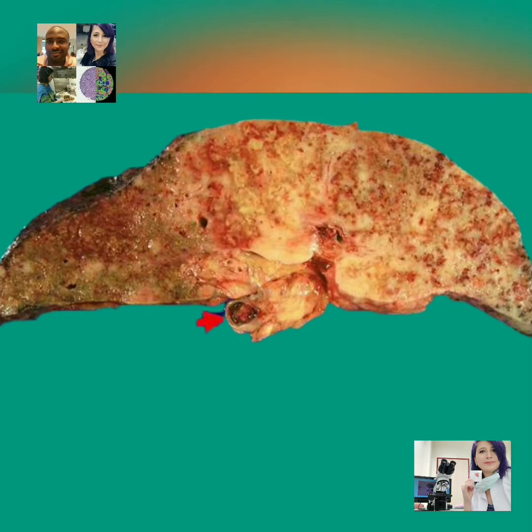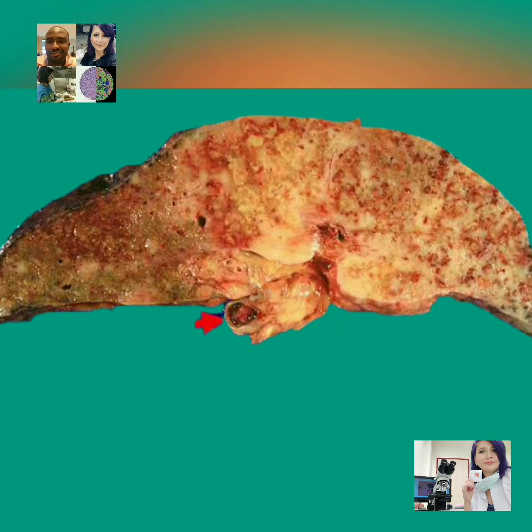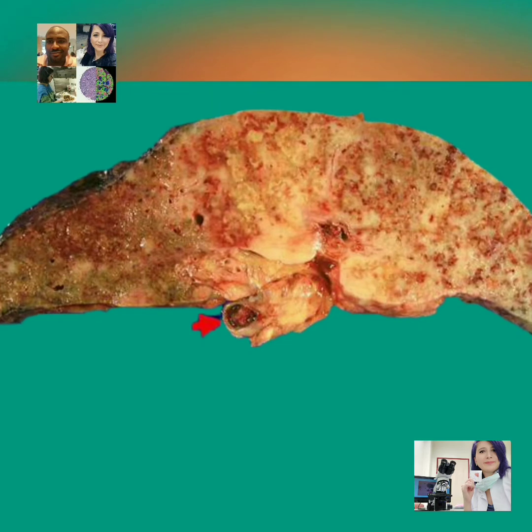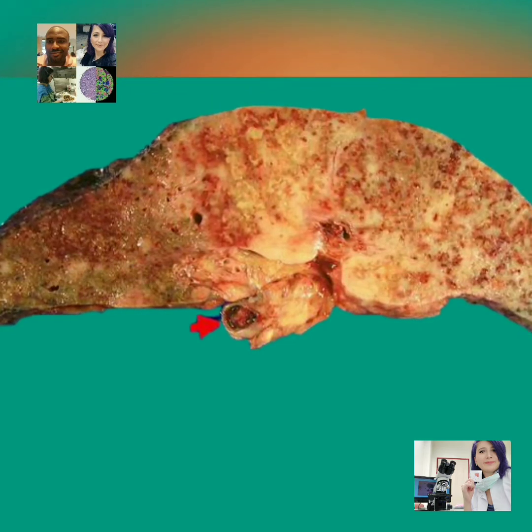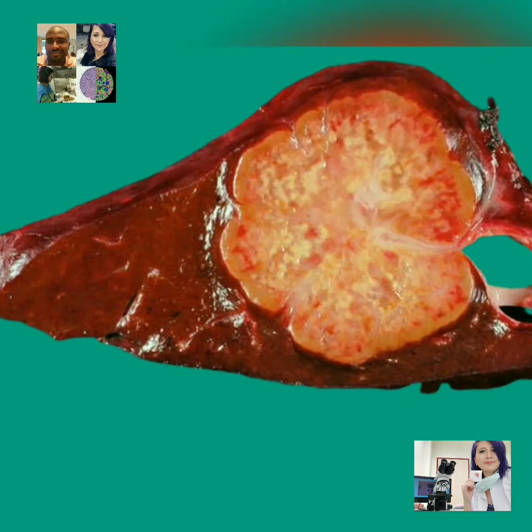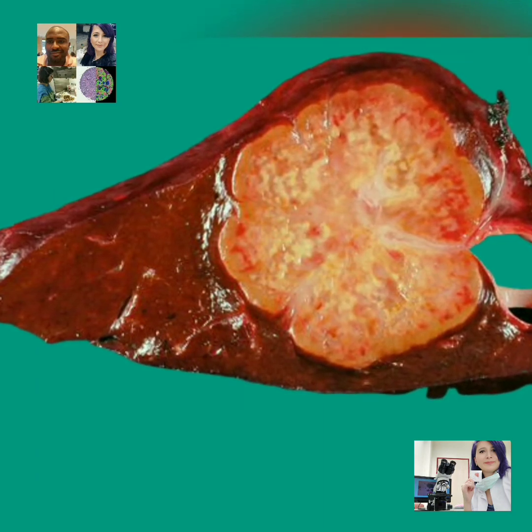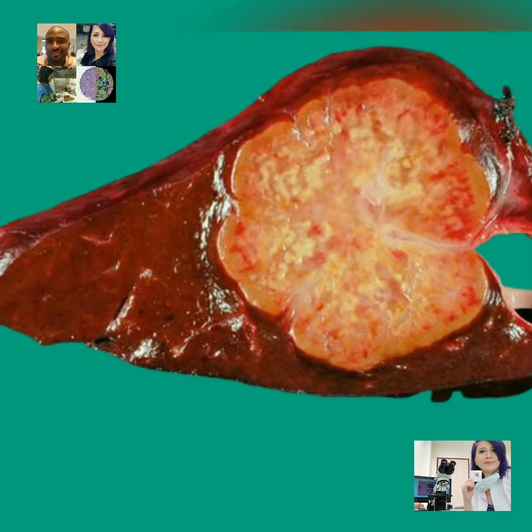This should be examined to determine if it is intact or normal, breached by tumor nodules, or stained by pigment, or to be assessed for the presence of scar or sutures, which may indicate a previous history of surgery. Lastly, the integrity of the specimen should be described with regards to consistency, friability, fragmentation, etc.